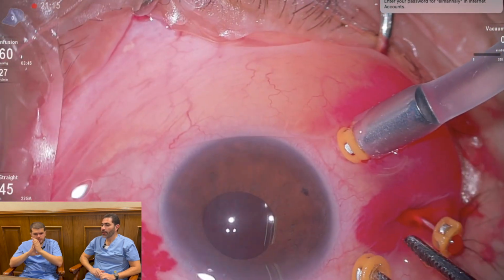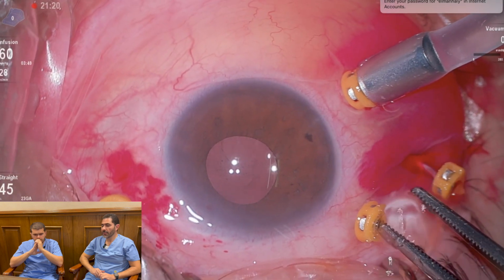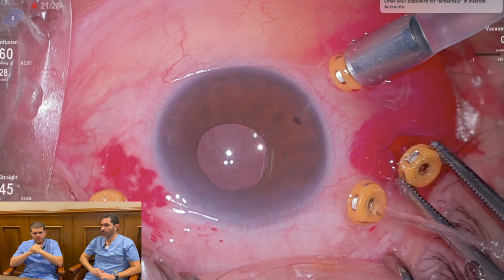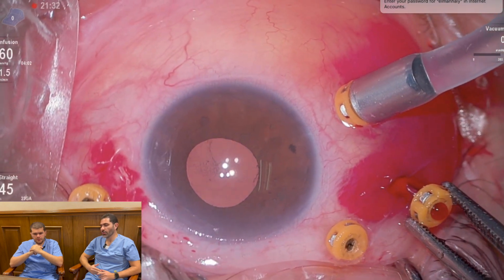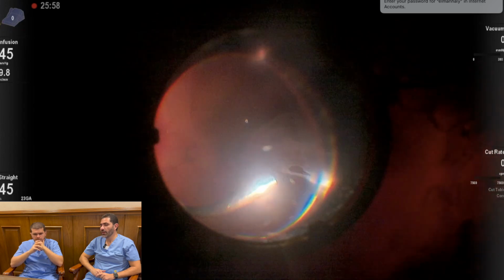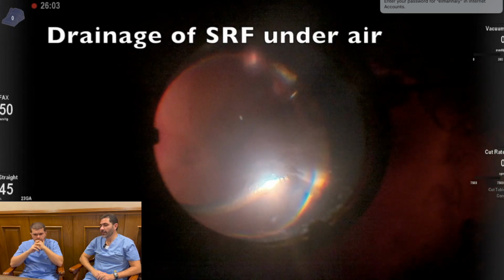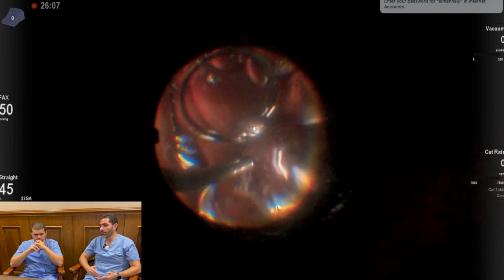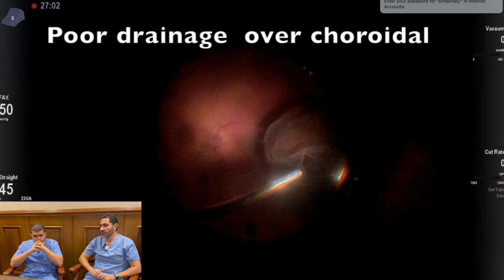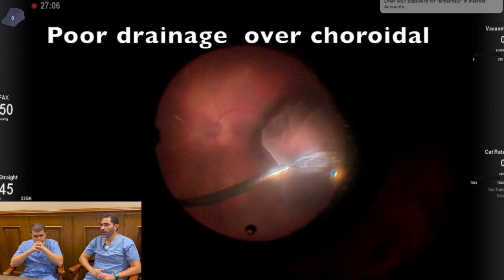Is the patient on sedation, right? Yes, he's on sedation, and I injected a subtenon block, so it is not painful. The patient is just moving his eye, that's why I said. And that is because this is the main tear that he was presenting with at the first visit, and it was very simple to go for a scleral buckle, even a segmental buckle.